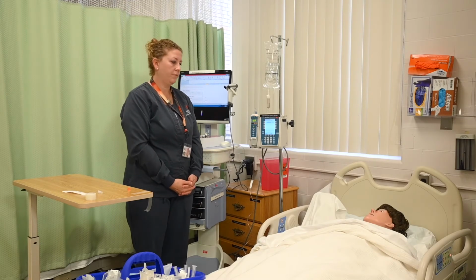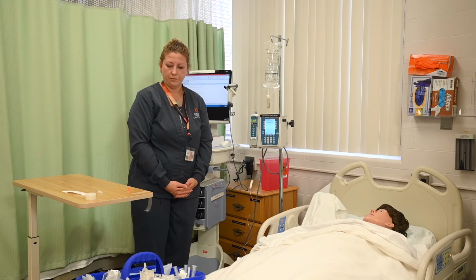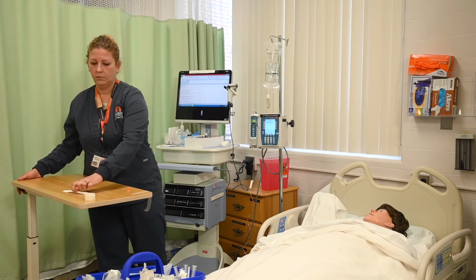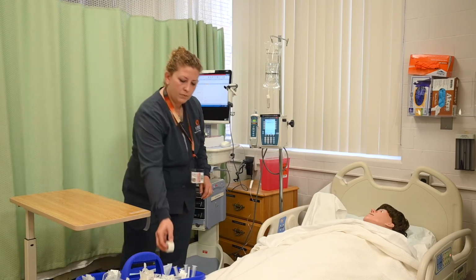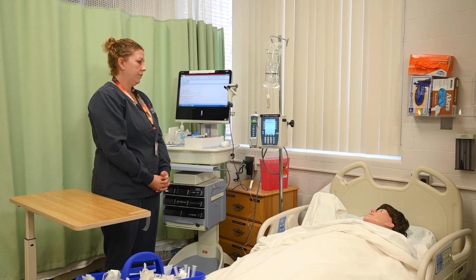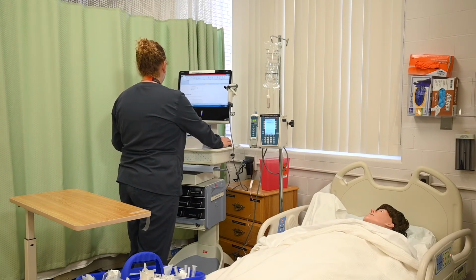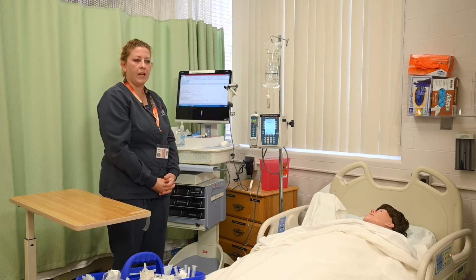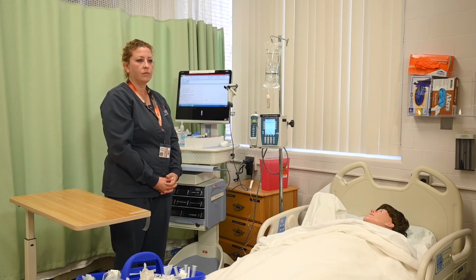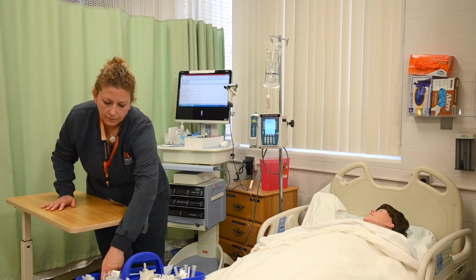Okay, this is the end of the insertion. Then we can move to discontinuation of the IV. So the patient is ready to be discharged. Sarah will come in and verify the healthcare provider's orders for the removal of the catheter. I have an order to remove your IV catheter today. Gather necessary supplies: 2x2 gauze, tape, and clean gloves.